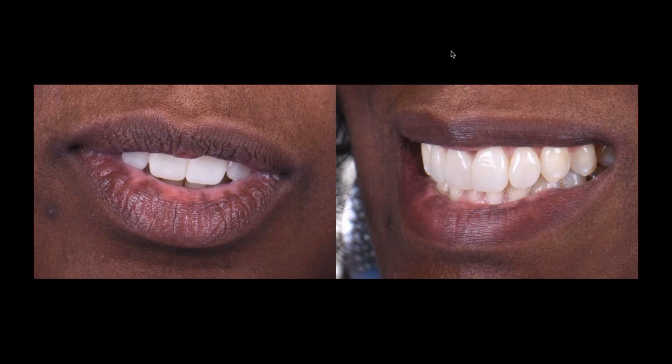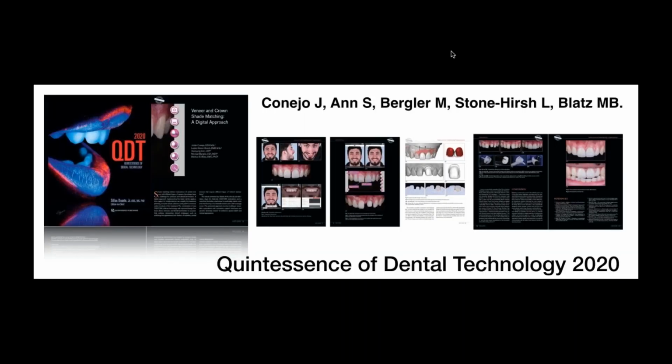Okay, so I try to place a 000 retraction cord, finish my margin with that, and if there's any areas that I need a second cord, I pack it, and as soon as I'm ready, take them out and make my intraoral scan to reduce any possibilities of irreversible soft tissue retraction. Okay, so that's a typical case I do with a CEREC system. Any chairside CAD/CAM system, you'll be able to do that.